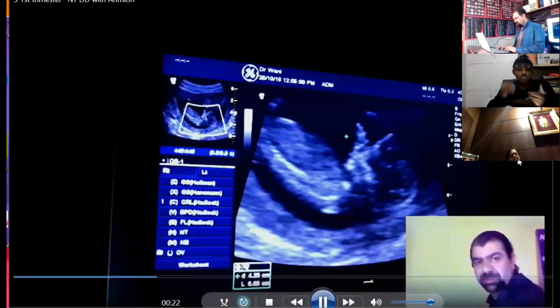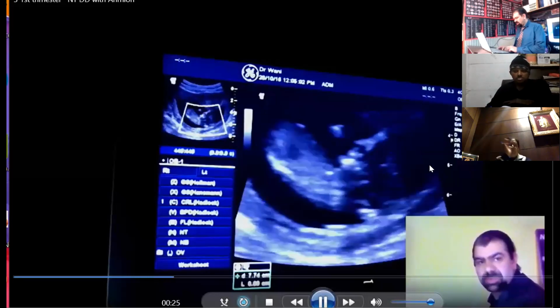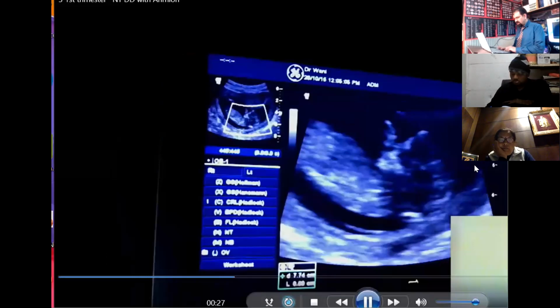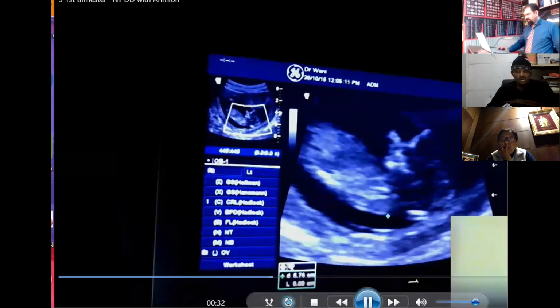Now this is the third case over here. Sometimes you can be confused with nuchal translucency. These things are already taken within your course. I'm just giving you some important cases over here. I'm discussing this because people can commit blunders, especially those who have just started their career.